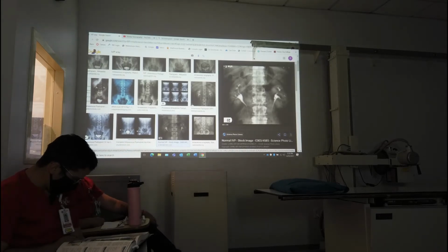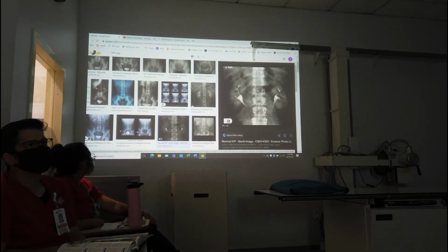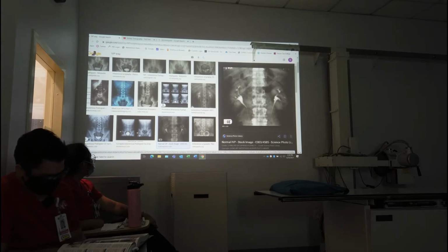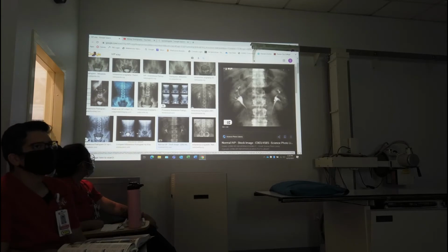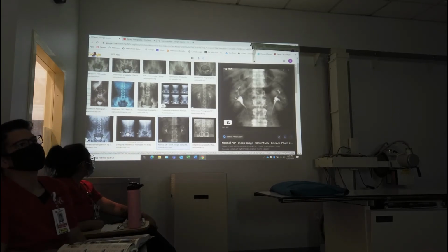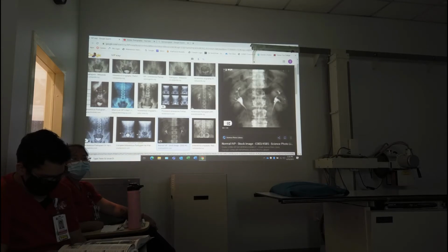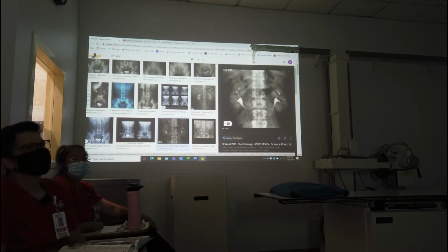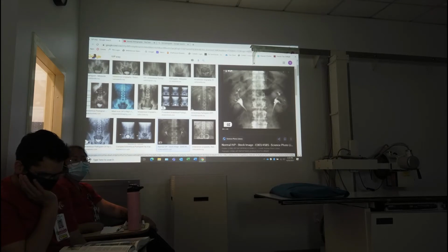So anyway, for the moderate stuff, you just need to let a physician know. Say, hey, we've got a patient we're doing IVP on. Actually they know we're doing IVP because they have to be in the department. But you have to let a doctor know the patient has hives. Hey, just to let you know, we injected this patient, it's been 5 minutes, and they're starting to break out in hives. Just an FYI in case anything gets worse, so they can be on alert. It doesn't require immediate attention with the moderate effects, but somebody has to be told what's happening.